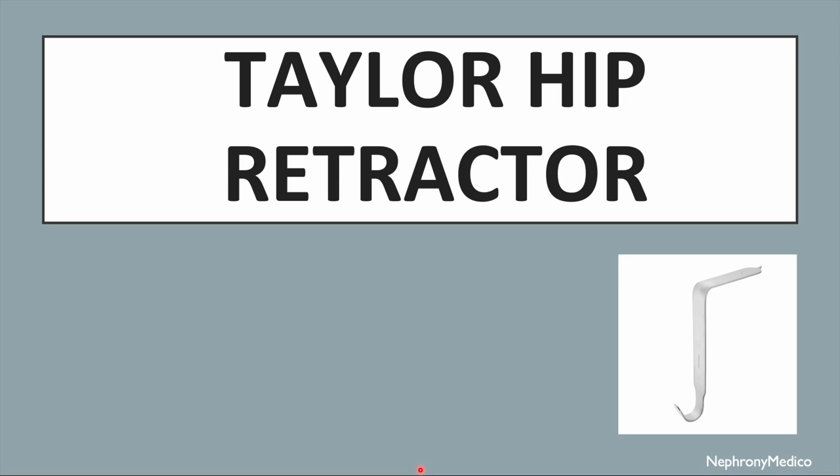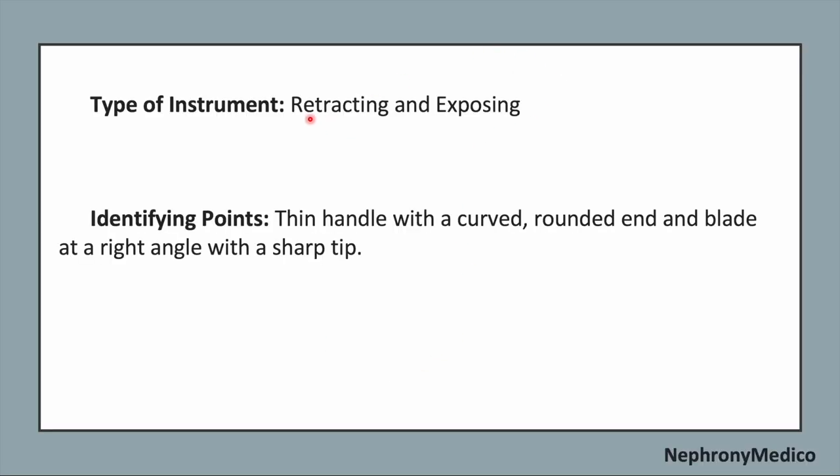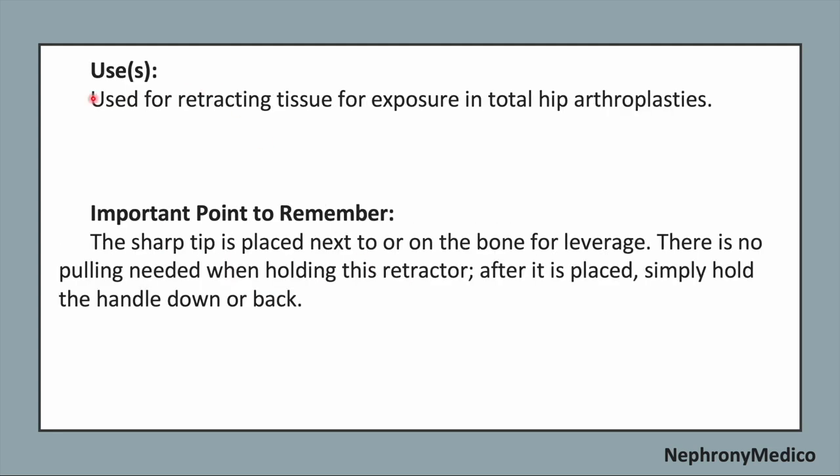Let's talk about Taylor hip retractor. This is a picture showing Taylor hip retractor. It is a retracting and exposing type of instrument. Now, identifying points. The thin handle with a curved rounded end and a blade at a right angle with a sharp tip. Use. It is used for retracting tissue for exposure in total hip arthroplasties.